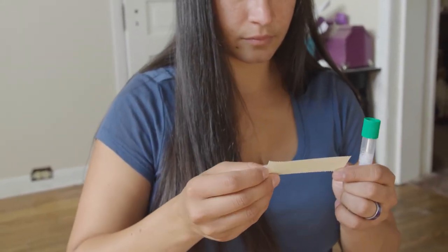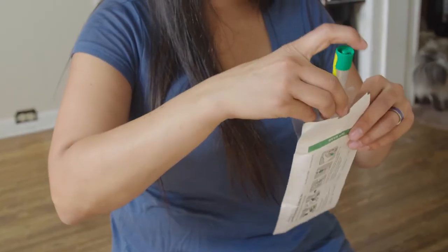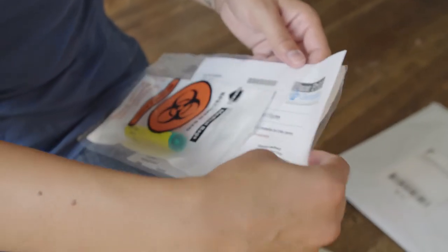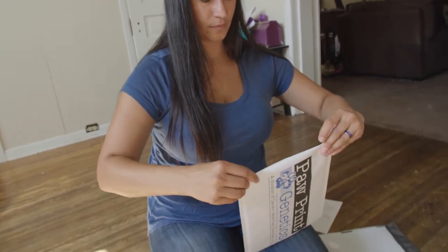Review the label for accuracy and apply the label to the tube. Place the collected sample back into the specimen bag provided along with a printed copy of your requisition form. Seal the bag and put it in the padded envelope.